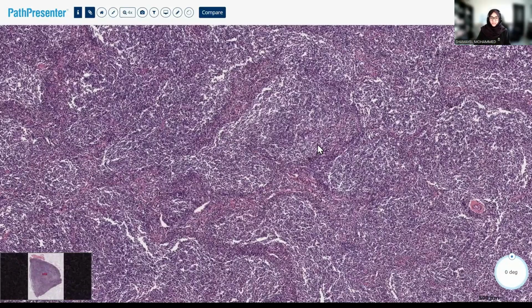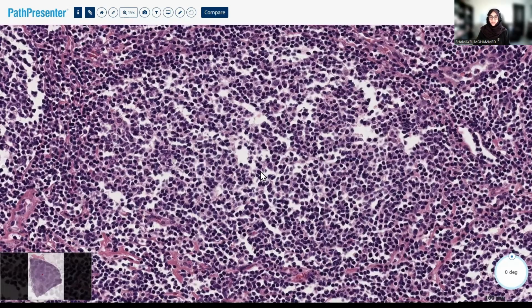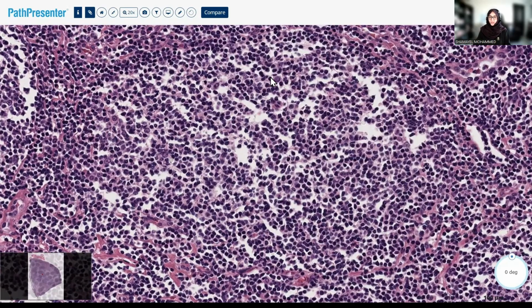Differential diagnosis of this pattern: we are thinking of a lymphoid infiltrate. It appears to be neoplastic because it is monotonous. There's no mixture of lymphoid cells. There's no polymorphism. All you can see is monotonous sheets of these small to medium-sized lymphoid cells. Over here, you can see maybe one larger lymphoid cell, and it is growing in a follicular/nodular pattern.